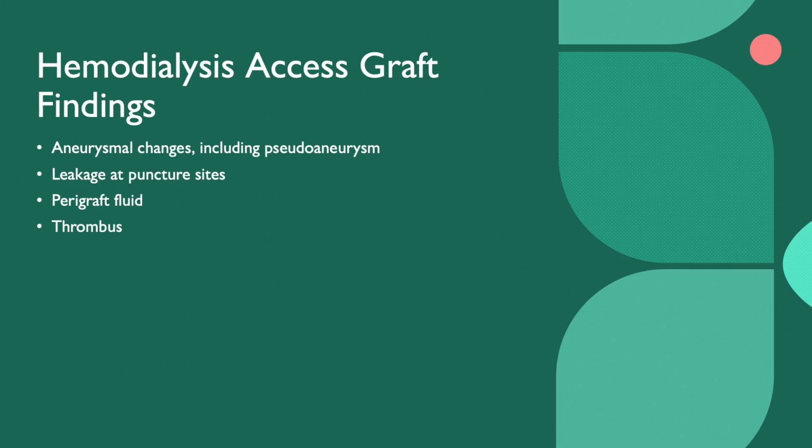So again, we're checking for, is this fistula or graft when you scan it? Is it aneurysmal, a pseudoaneurysm, leaks, fluid, thrombus, all these things? These things can get really big. They can get kind of nasty. They're going to leak a lot because they're getting stuck 3 times a week at dialysis. To have a fistula, it's a job. I mean, it's a big job. It's really difficult for the patients. Again, it's their lifeline.